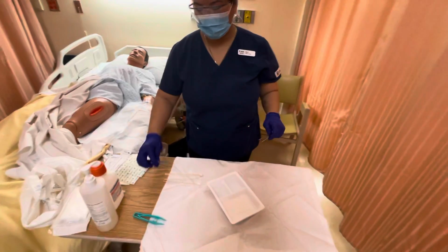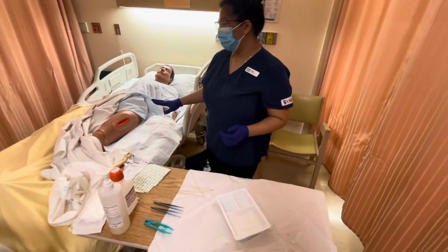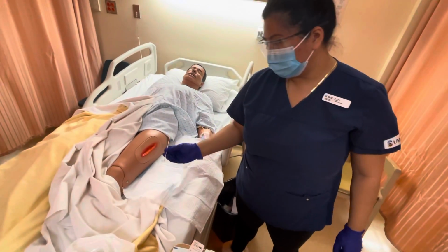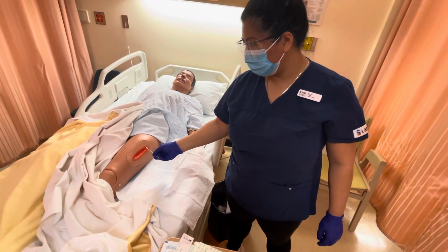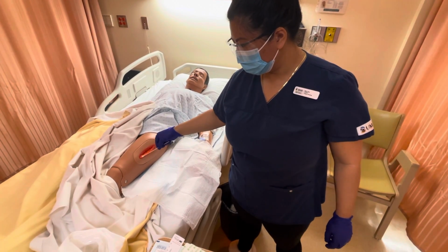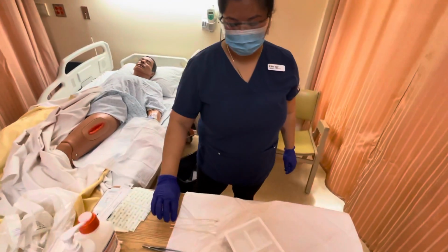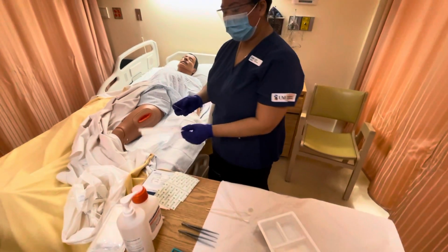Now that the wound is dry, we can assess it. So we want to take note if there's any tunneling or undermining. We want to start in the direction of our patient's head and move clockwise, assessing for tunneling or undermining, and there is none. And then we want to measure the wound. So we're going to measure the length, the width, and the depth.